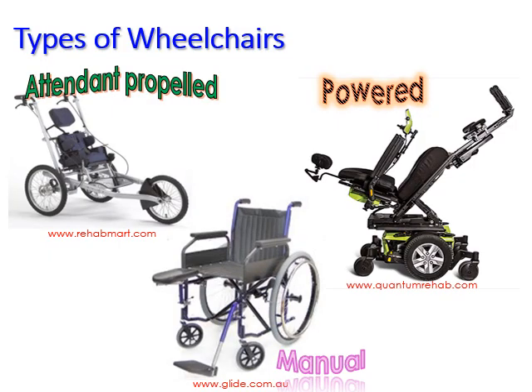I mentioned being pushed in a wheelchair, and we call that attendant propelled. That is usually a manual wheelchair, one that's pushed by somebody else. It's not going to be one of those motorized wheelchairs. Examples of attendant propelled wheelchairs could be an airplane aisle transit chair.